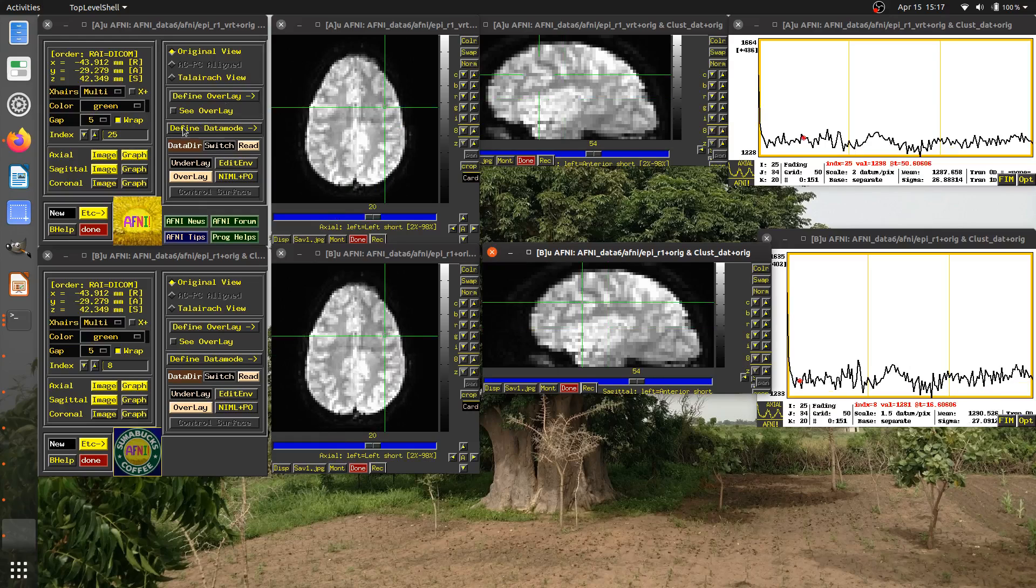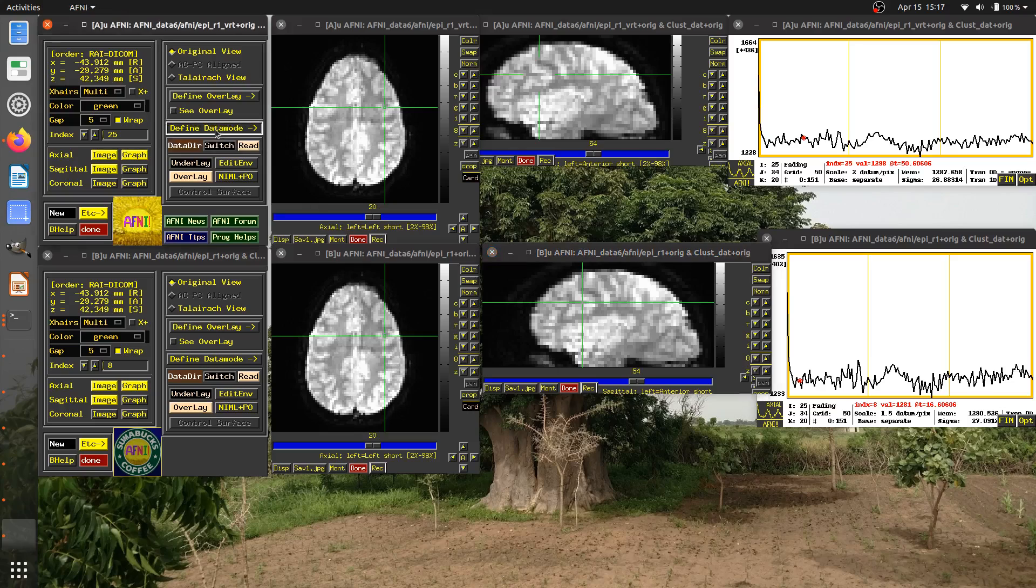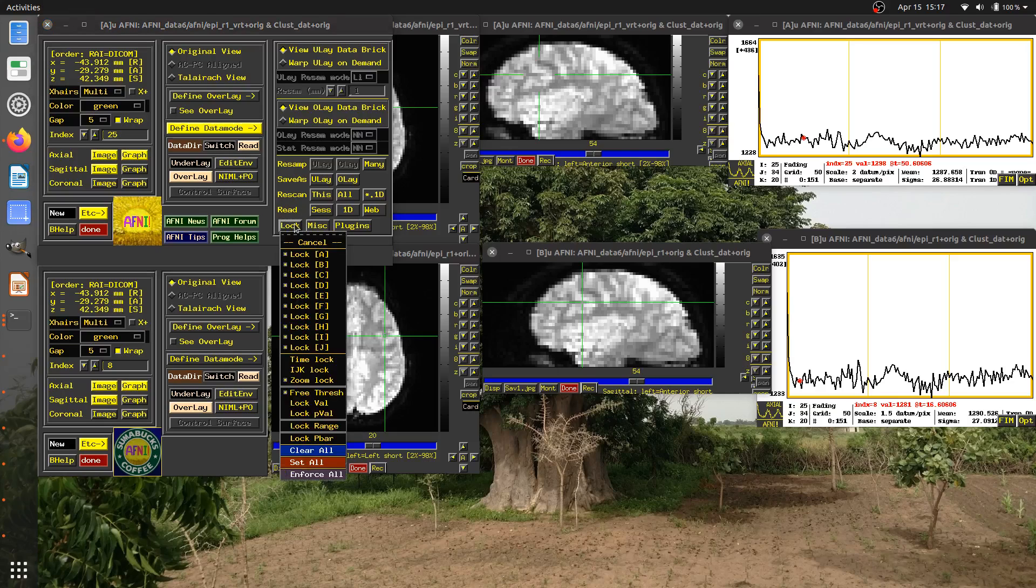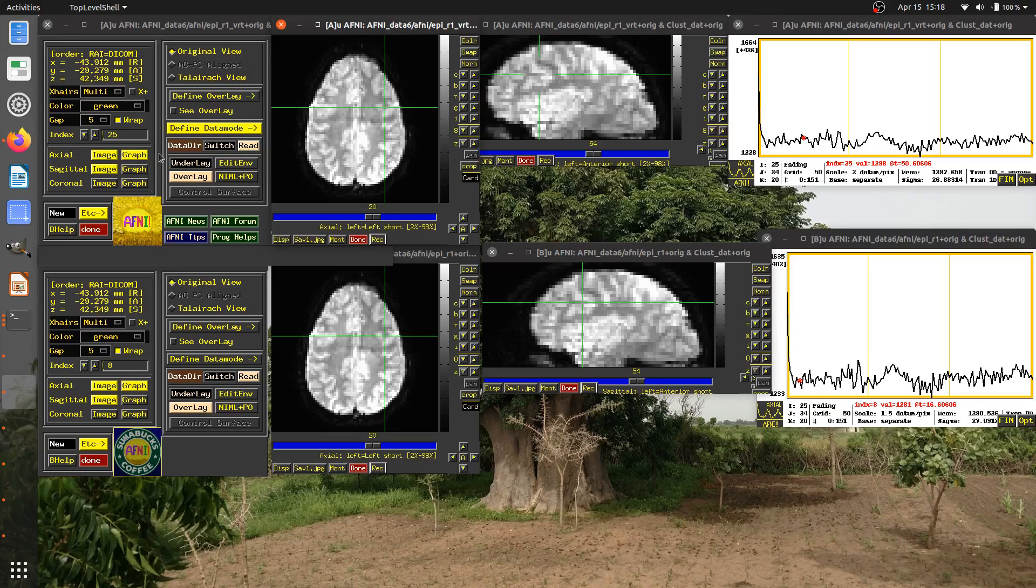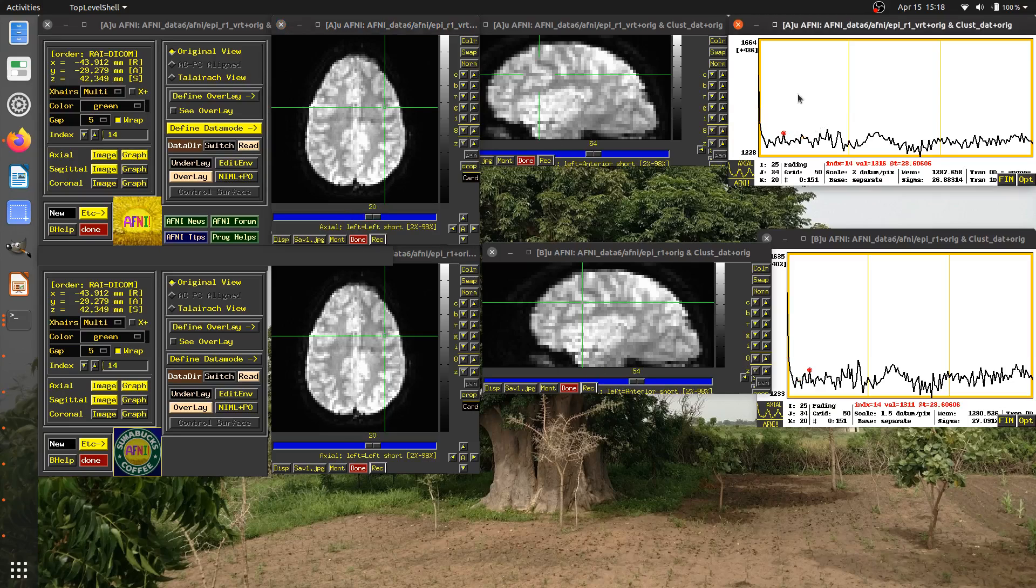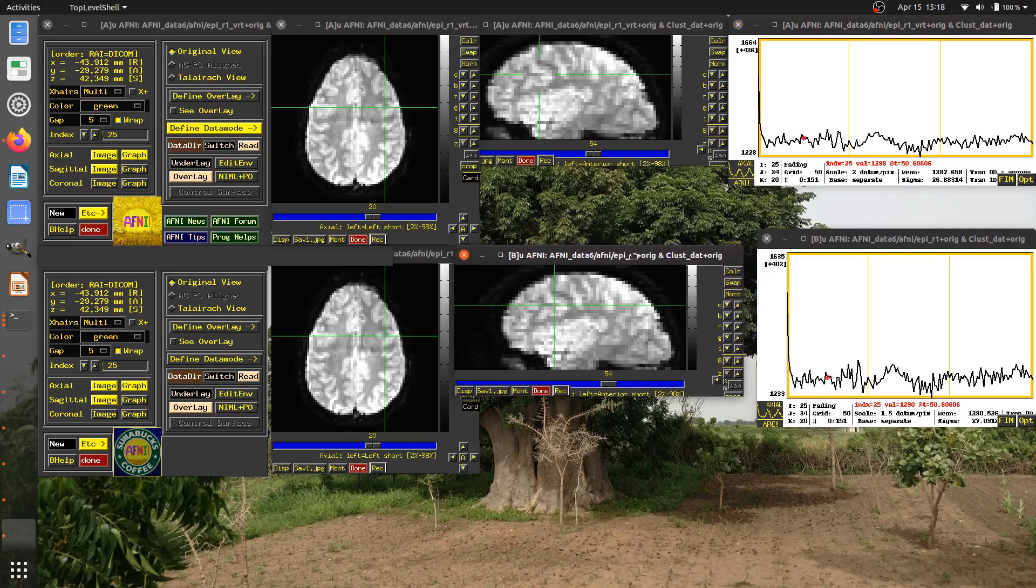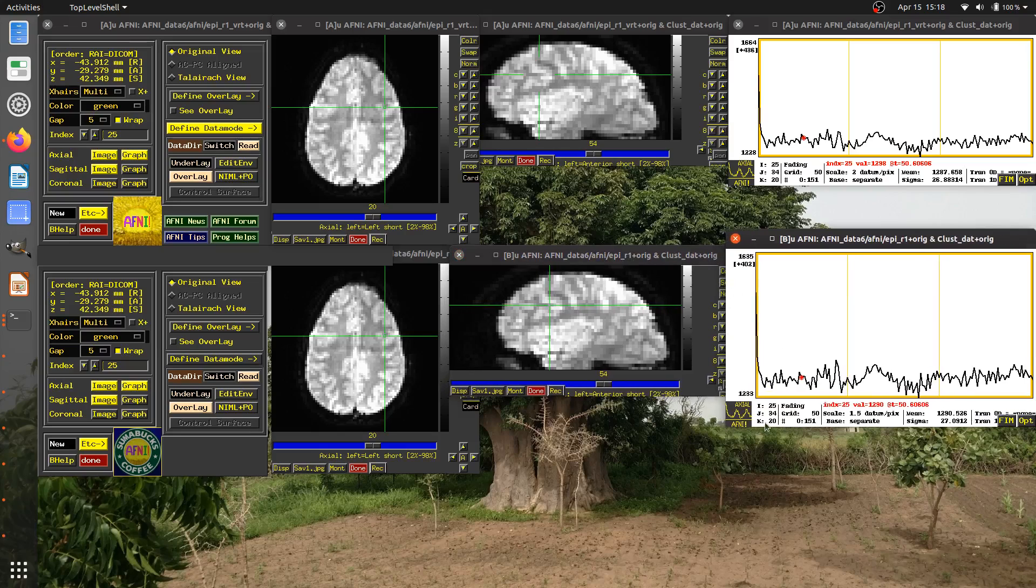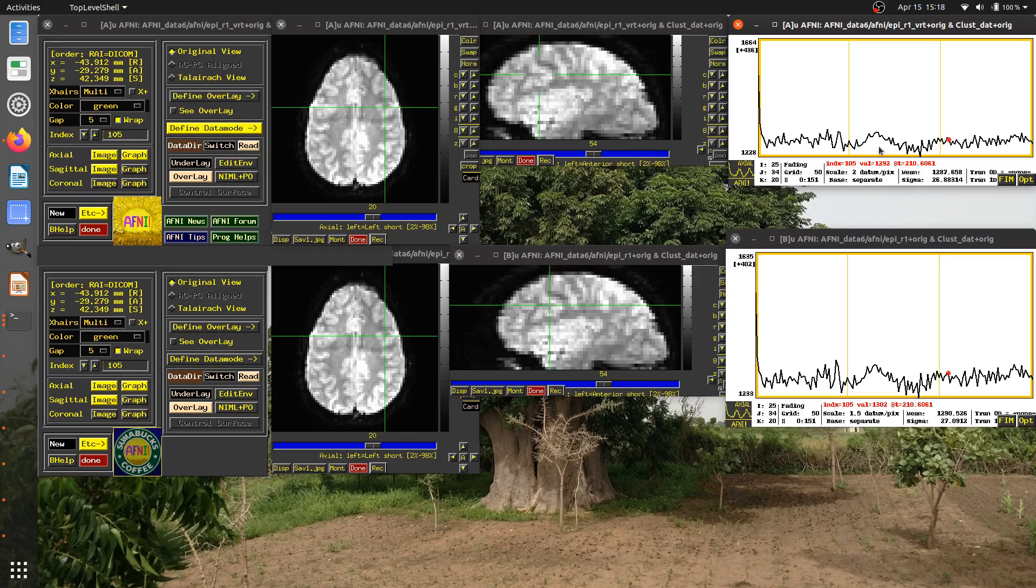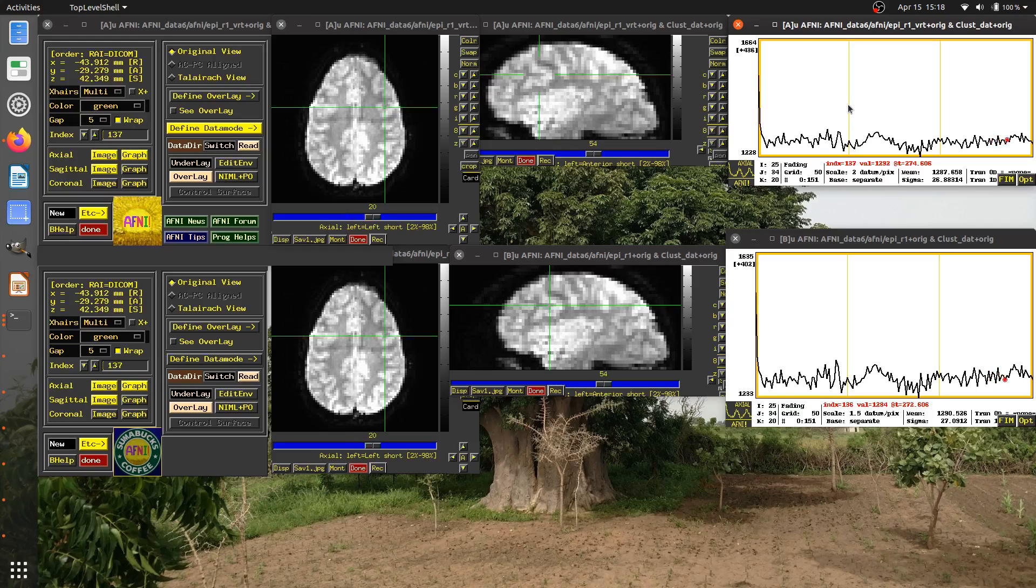How can I go about doing that? Spatially, they're locked, but not in time. Well, let me go to define data mode in either controller. And here there's a button called lock. And if I click on that, I see that there's an option for time locking, which is not selected. So I'm going to select time lock. Now, if you notice, nothing looks like it's happened. This dataset here is still at index 25. This one is still at index 8. However, if I click somewhere here, now you'll see that they are, in fact, linked together at the same time.